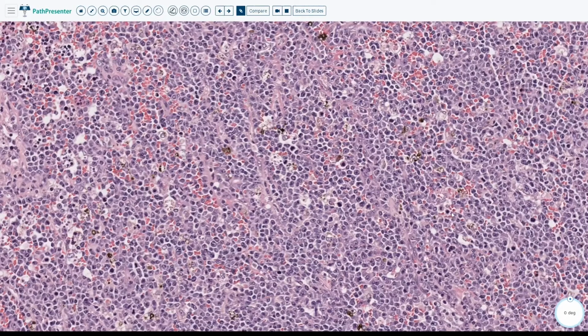These cells are relatively large, but still somewhat atypical. It's unfortunate that this is the highest power that we can go on. But if we compare them to the red cells that are here, we can see that they're roughly the size of a red cell. So we're in the lymphocytic type range, but they're still somewhat large and somewhat atypical even for lymphocytes. Good amount of mitotic activity. We can see mitotic figures.